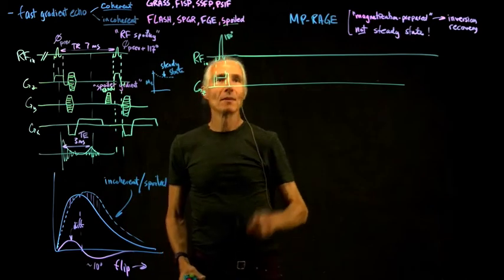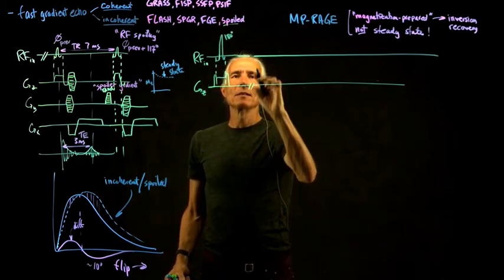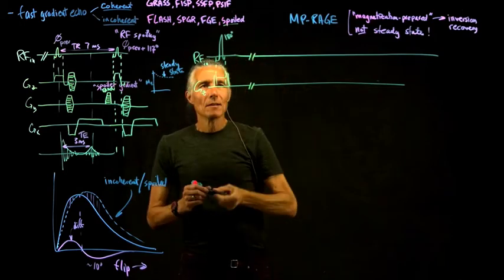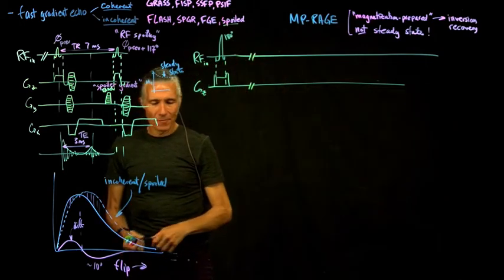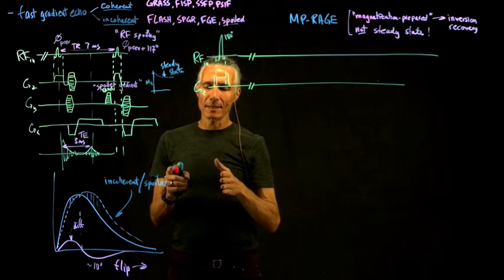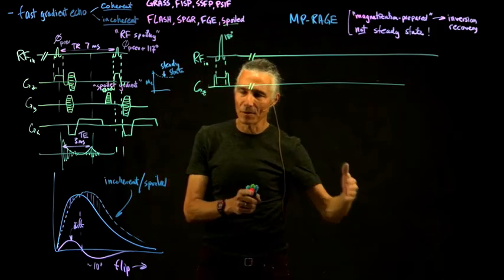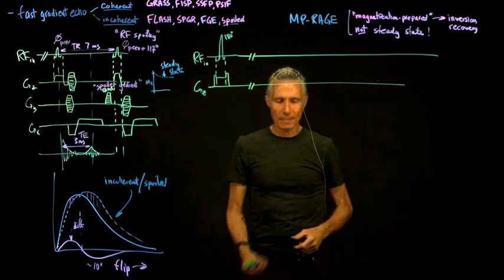So then we wait a while, and if you listen to an MP-RAGE, you'll hear a tick, and then a little bit of a space, like half a second, and then you'll hear another tick, and then a little space. You can hear these repeated spaces.